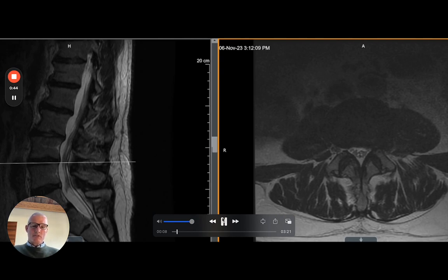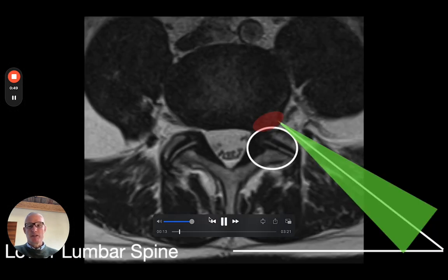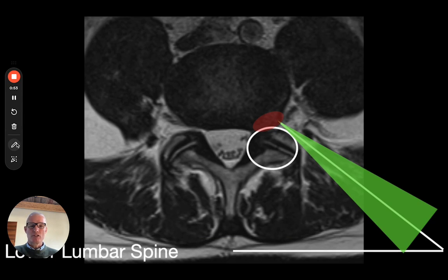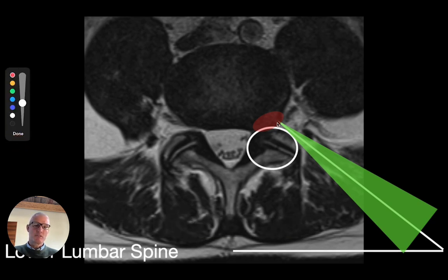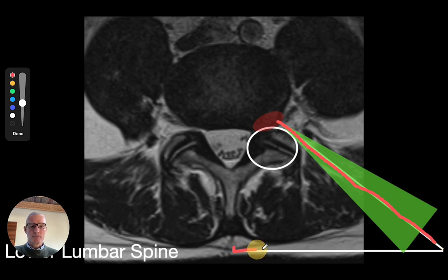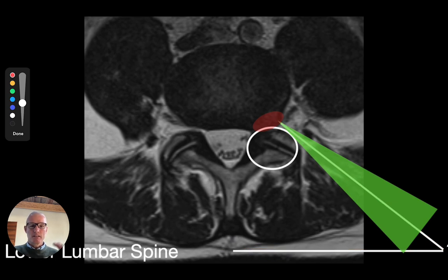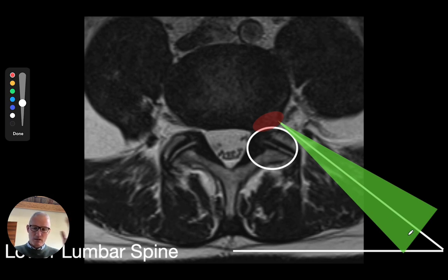I'll walk you through my technique for targeting. What I like to do initially is take the preoperative MRI scan and establish a trajectory using the digital calipers from the pathology to the skin and then measure the horizontal distance from the midline to that starting point. However, there's a caveat here. The size and shape of the abdomen changes significantly from the supine position in the MRI scanner to the prone position on the operating table, so I use this just as a way of getting my mind thinking about what this trajectory is going to look like.